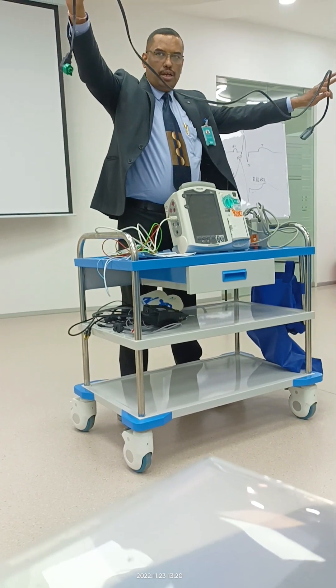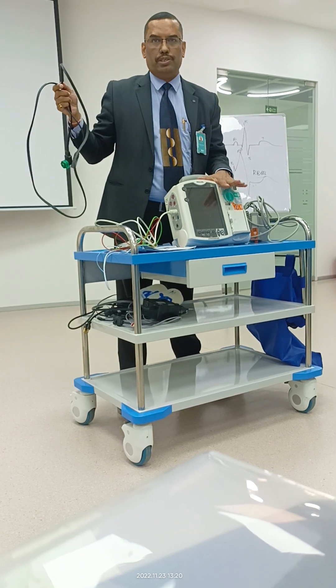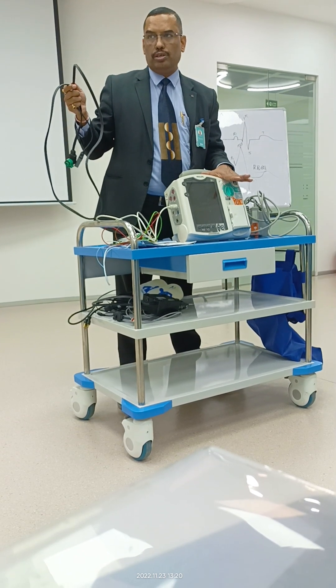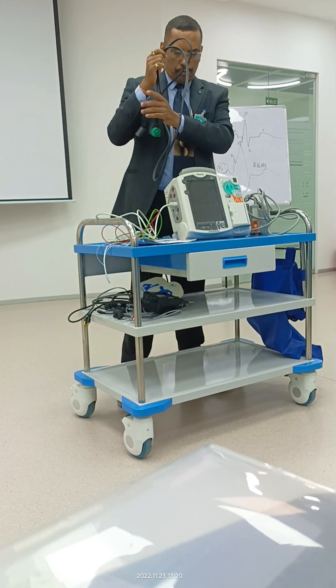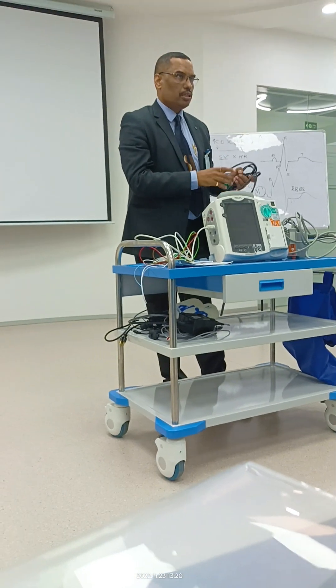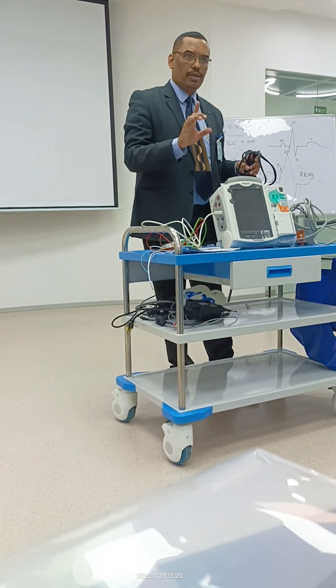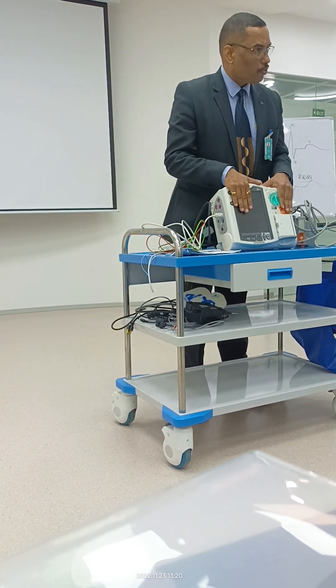The pads cable comes along with a defibrillator that has a pacemaker option or AED option — it doesn't come separately with other defibs. So if you don't have these cables, that means there is no option for pacemaker or AED.